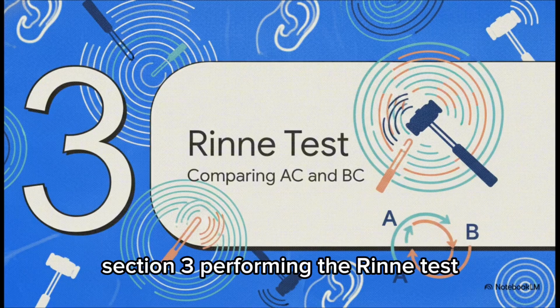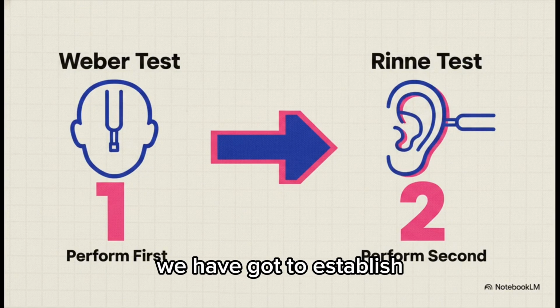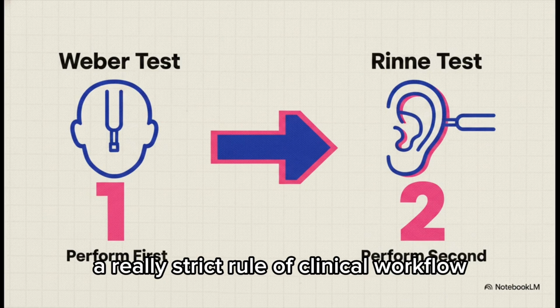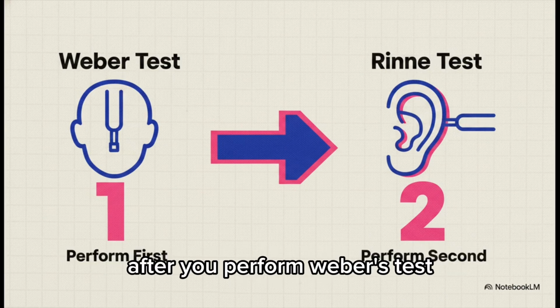Section 3. Performing the Rinne test. Before we even look at how the Rinne test is done, we have got to establish a really strict rule of clinical workflow. You must be absolutely sure to perform the Rinne test after you perform Weber's test.